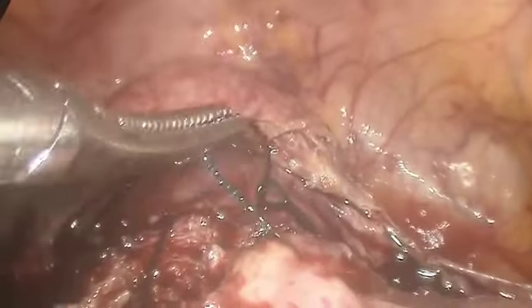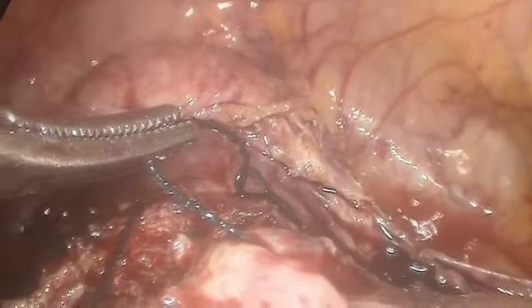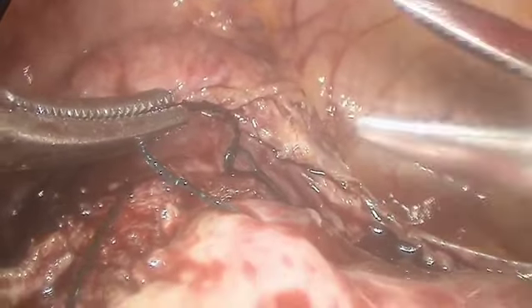Once the opposite corner is reached, the suture is sequentially tightened, bringing the defect edges neatly together. This creates a strong, watertight closure of the lower segment.